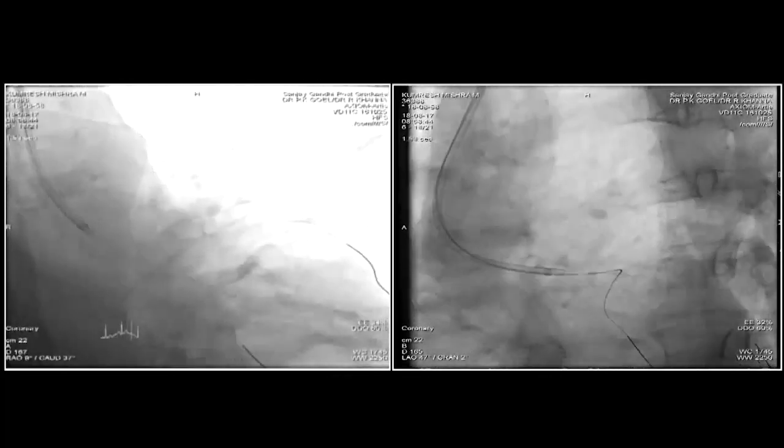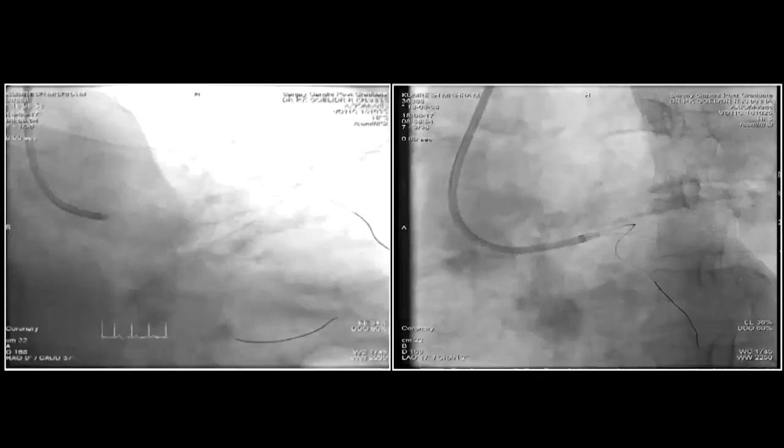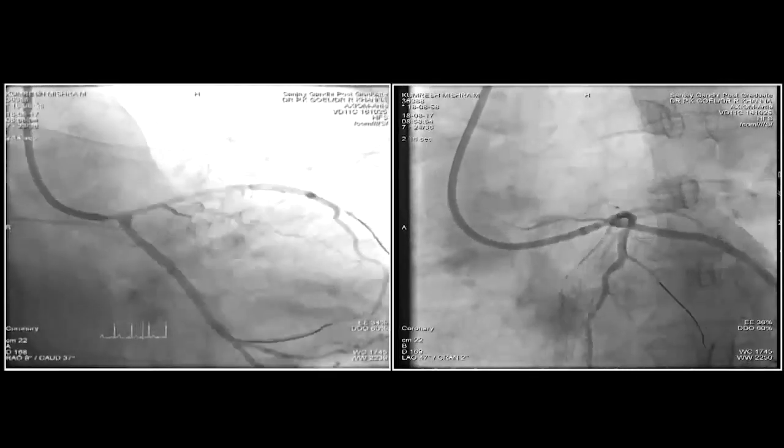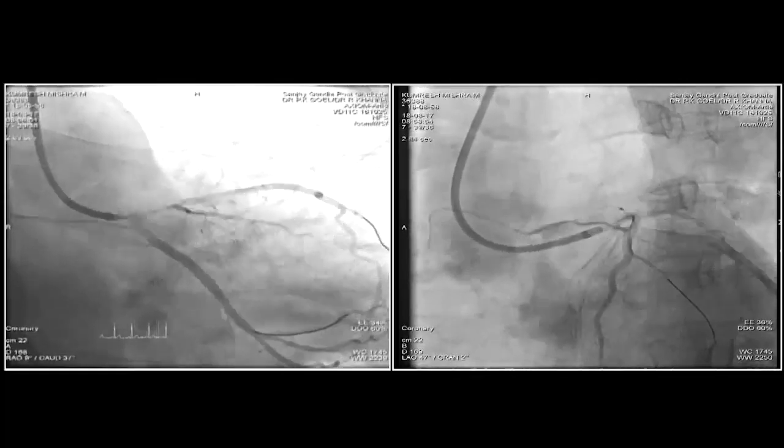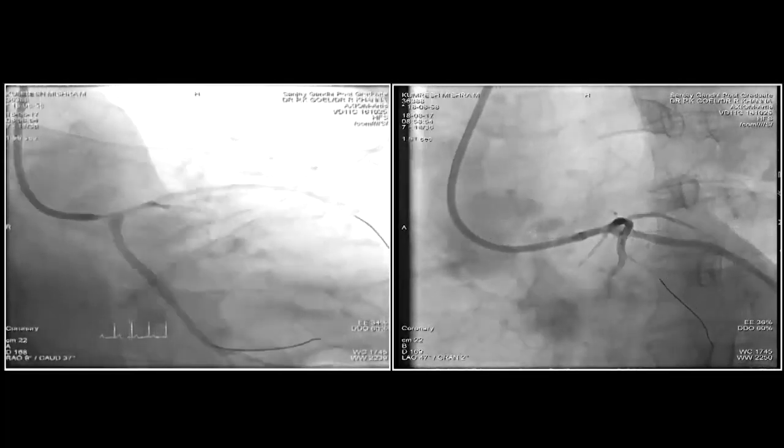And after the cutting balloon, we have the angios. So that's the cutting balloon. Only problem with the cutting balloon, Dr. Goel, is that sometimes if the lesion is too critical, these balloons are slightly bulkier than the regular balloon. You may find it difficult. It will not go.